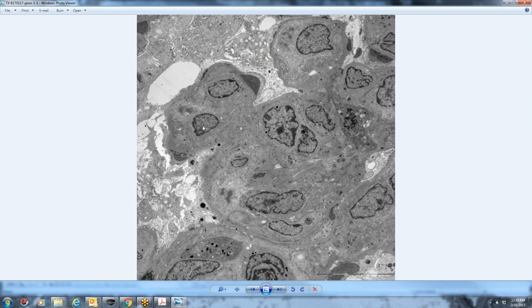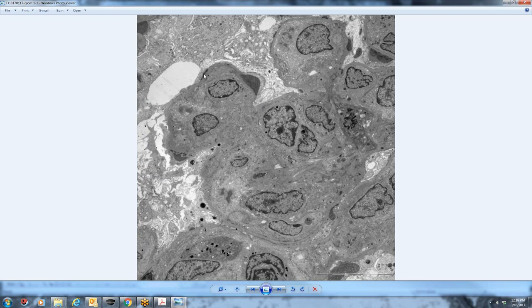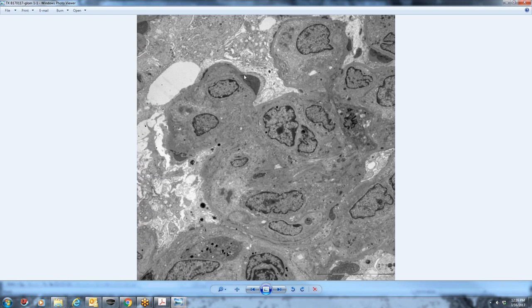We still have the hypercellularity in the capillary loop. The GBM is still fairly normal thickness. What's cool about this case is they have these really large electron-dense sub-epithelial humps. There's very minimal reaction of the glomerular basement membrane to the presence of this material.